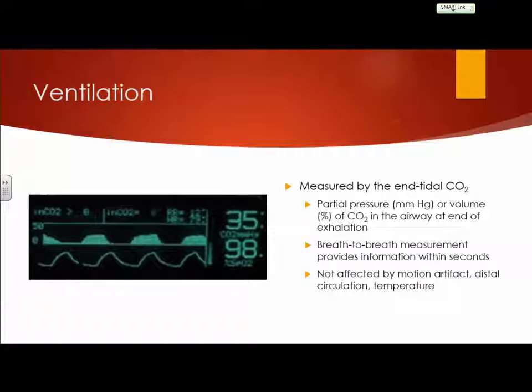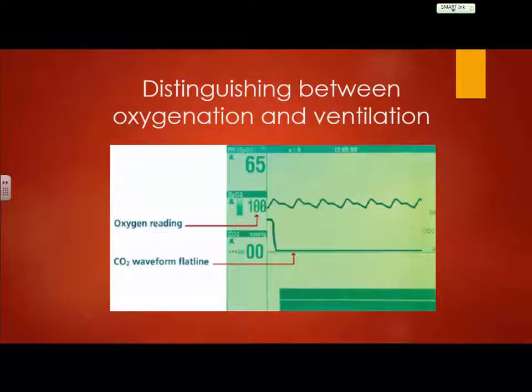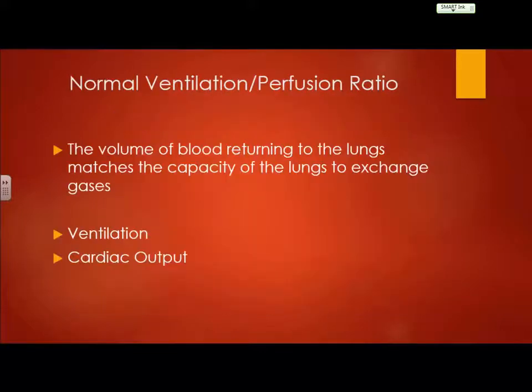But all in all, if you put this on, it should give you what you need to know as far as when you've intubated a patient or when you put the nasal cannula on. All right? So, now, with your SpO2, it will give you a plethora of waveforms sometimes, but we're not going to talk about those waveforms today, but do know that you can have those. If you're measuring CO2, you need to make sure you've got your monitor set to where you get your waveform for your CO2 and your reading there as well, okay?